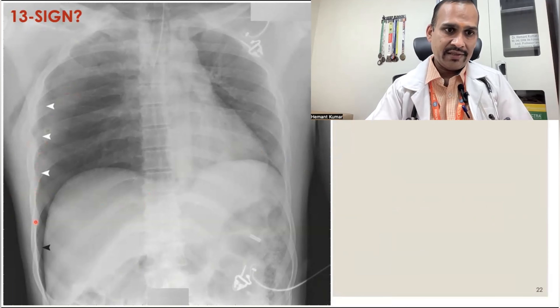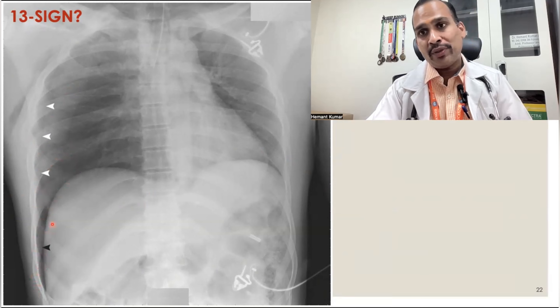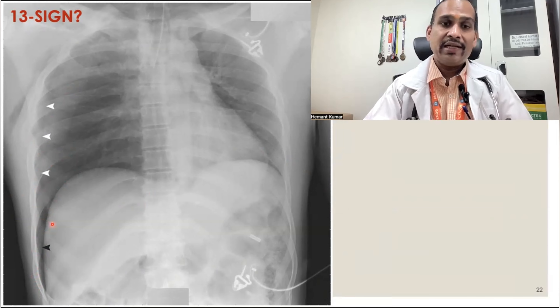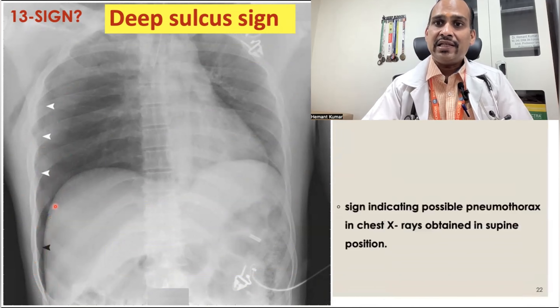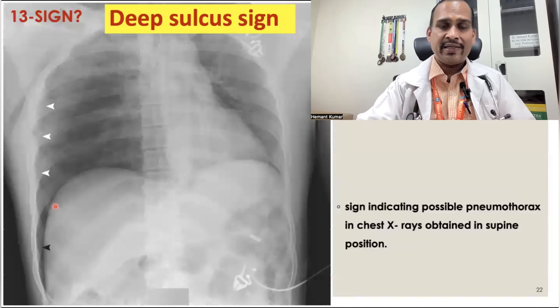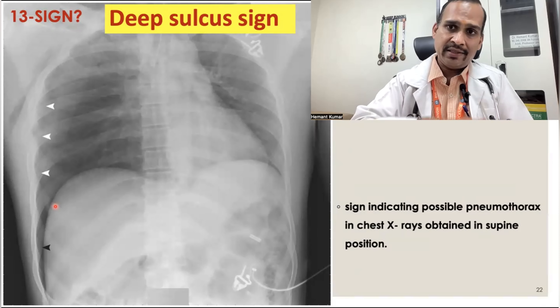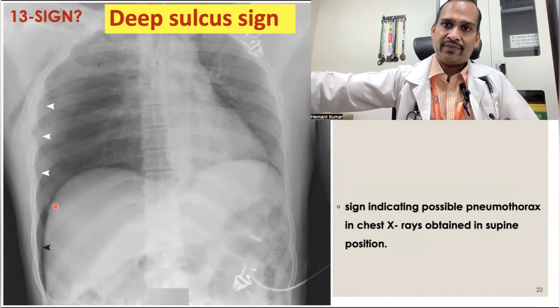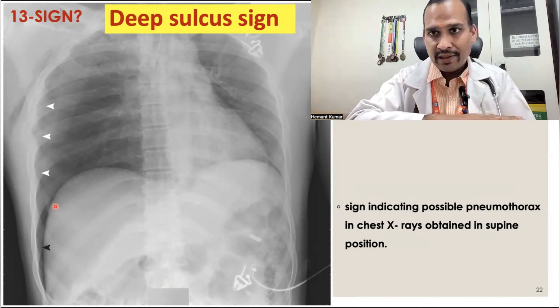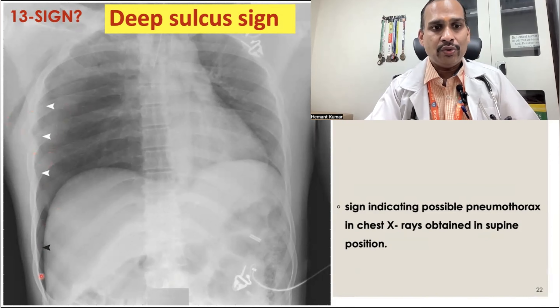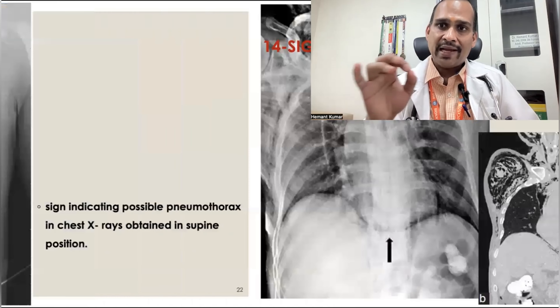Sign 13 is the deep sulcus sign — one of the most commonly asked questions in your exam. You can see the costophrenic angle is unusually sharp and deep. It is seen in pneumothorax, especially when the patient is in the ICU and the X-ray is taken in a supine position. In erect position, air goes upward, but when the patient is lying down, air goes downward, producing this deep sulcus sign.